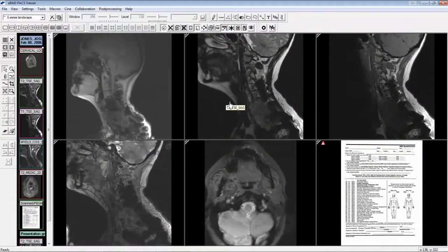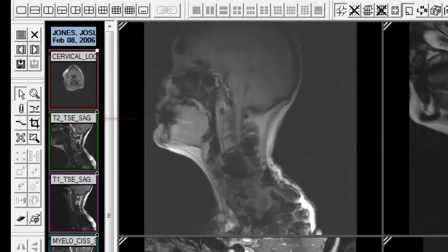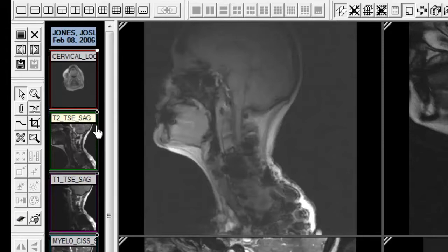Next, we will talk about new features and enhancements to the eRAD PACS viewer. After upgrading your viewer to the latest version, your viewer will have three basic changes that can be seen almost immediately. First, you will notice every thumbnail in the thumbnail panel will have a series description in it. Previously, the user had to mouse over the thumbnail to see its description.